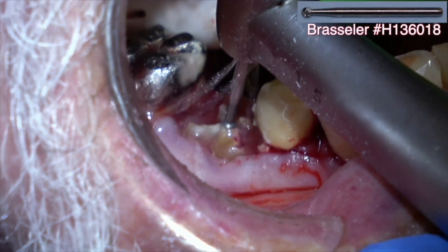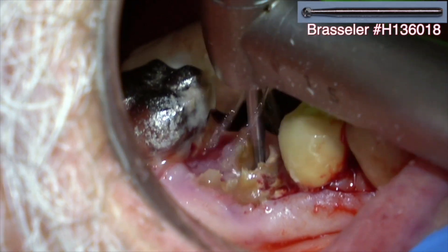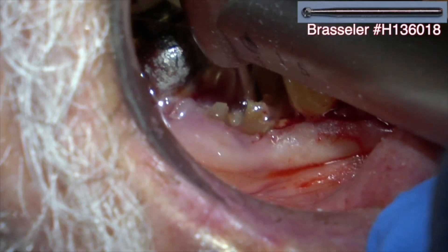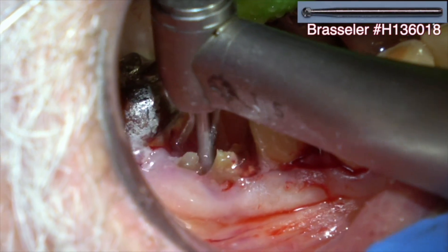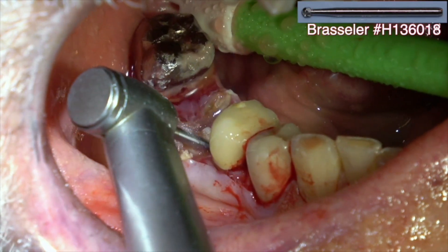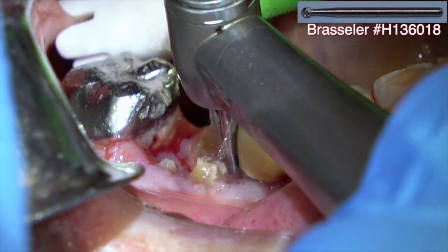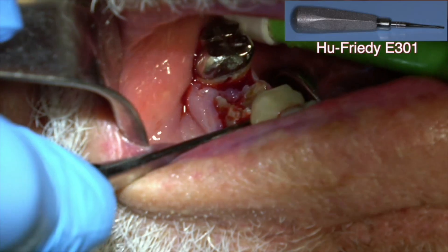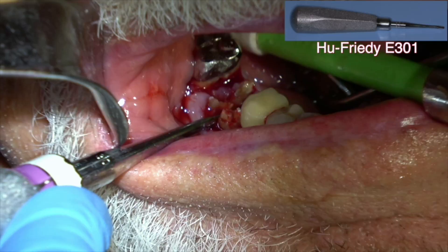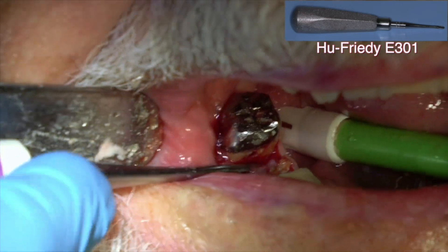This molar has got three roots — two mesial and one distal. I'm treating the two mesial as one root, and the distal root as one root, and I want to have space to elevate those roots in two. If I'm thinking I'm going to place implants later on, I want to preserve the buccal bone and the lingual bone. I don't care if I remove some of the bone interproximally — if I've got to remove bone, I'd rather remove the interproximal bone than the facial or lingual bone.